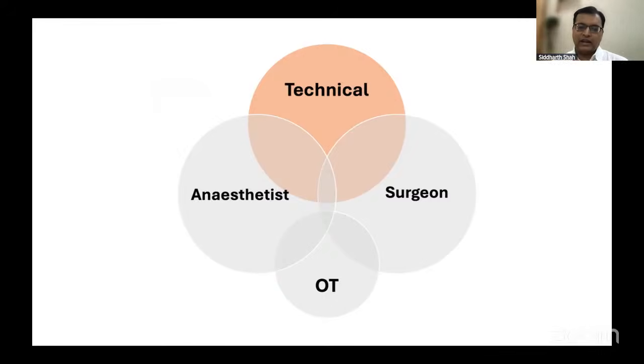Once we are doing the correction, we document that the correction has ended, all monitoring is fine. That's where the whole process stops, in the sense that we are now at a stage where there is no more variable factor from a surgical perspective. But of course, the anesthetic side and everything still continues.